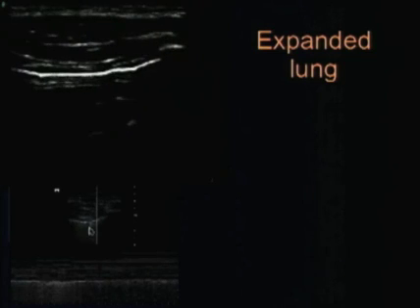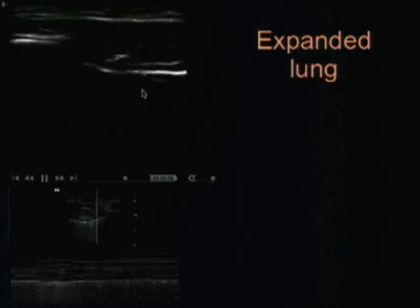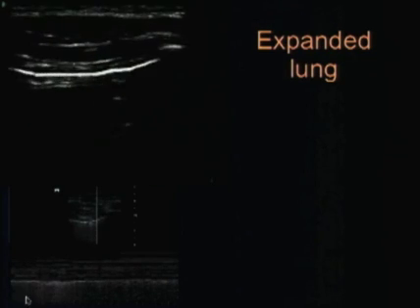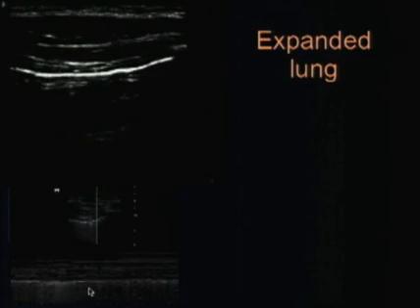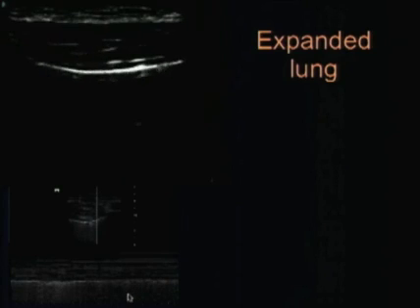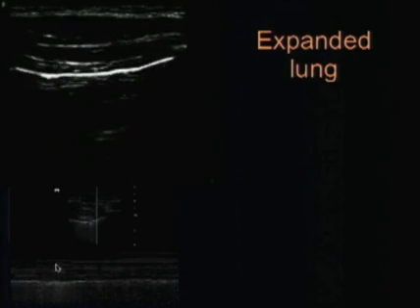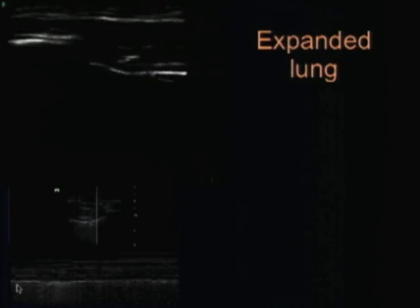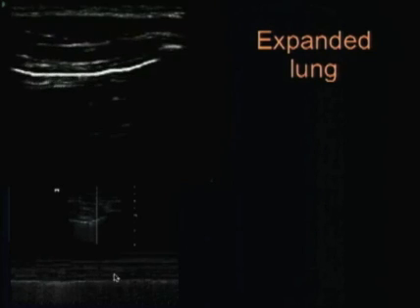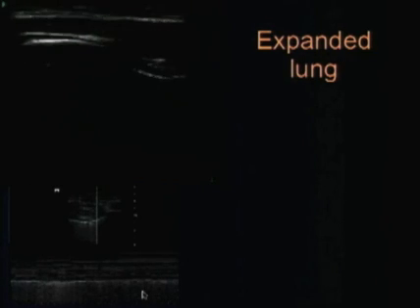And then beyond the pleural line, as a result of the movement of the lung tissue, similar to the movement that can be seen right here, which is very regular, you end up with this much more granular looking region down here, indicating the presence of lung. And for shorthand, this has sometimes been described as waves on a shore, waves on the beach. This is the sandy beach here. Here's a bunch of waves coming down towards it that look fairly linear. So you've got this granularity referred to as the sands of the beach.